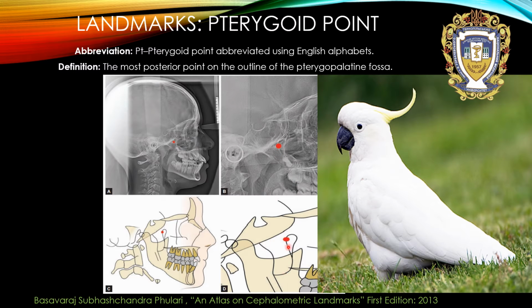Because this profile looks like a cockatoo, and this point is localized like the eye of the cockatoo, so this point is sometimes called the eye of the cockatoo.